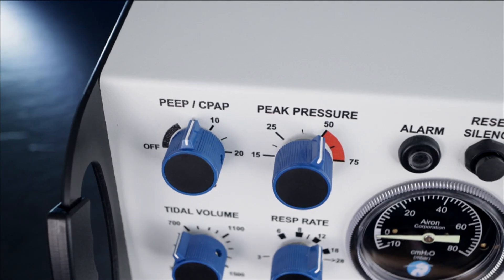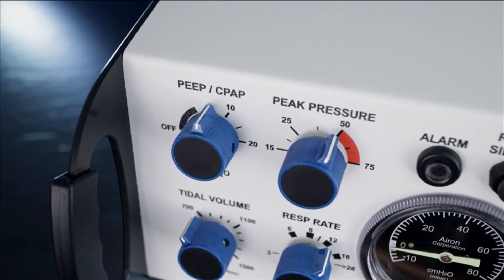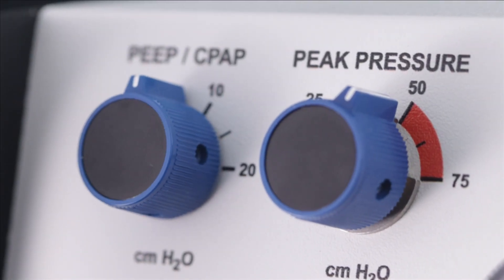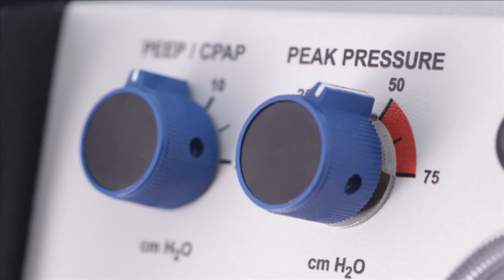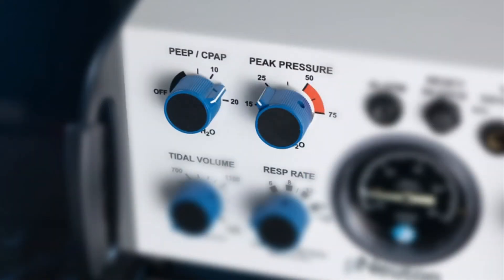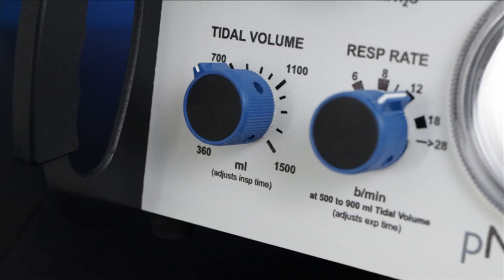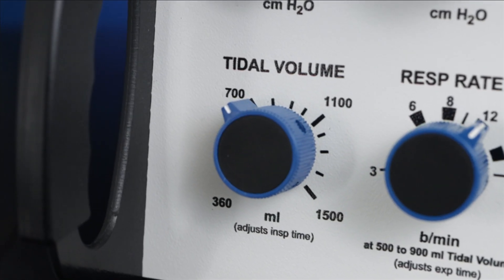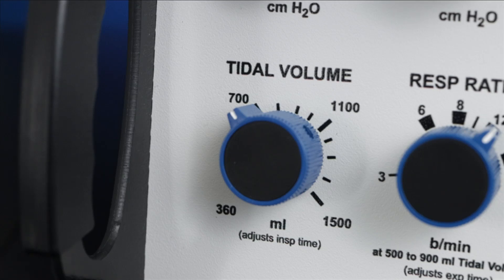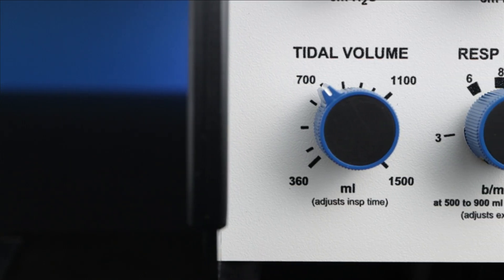Peak Pressure Control. To the right of the PEEP/CPAP control is the Peak Pressure Control, which limits peak airway pressure up to a maximum of 75 centimeters of water. In ventilation mode, set the pressure at a desired setting to assure patient safety, usually 10 centimeters of water greater than the delivery airway pressure, but please always use your institution's protocols. The Peak Pressure Control can also be used to deliver pressure-limited breaths during pressure ventilation with the CPAP/PEEP control as the low pressure setting. On the bottom left is the Tidal Volume Control with a calibrated range of 360 to 1500 milliliters. The Model A's flow rate is preset at 36 liters per minute for all mandatory breaths, allowing the patient to receive the set tidal volume with fixed inspiratory flow with delivered peak pressure monitored on the manometer.